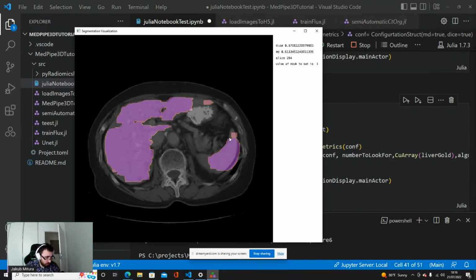So the spleen would be heavily penalized because it's far away. And the voxels that are just next to it, like here, will not be penalized so much. They would be recognized as a small error, and this will be recognized as a big error.